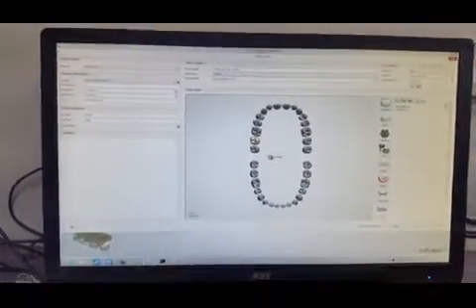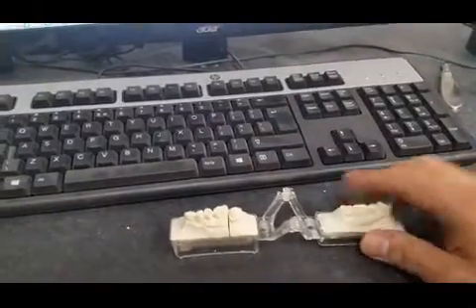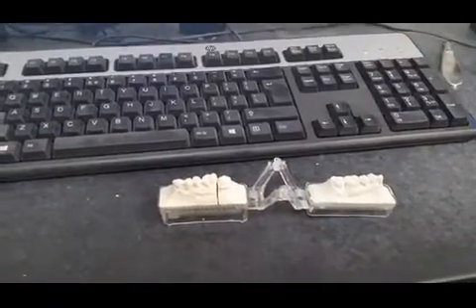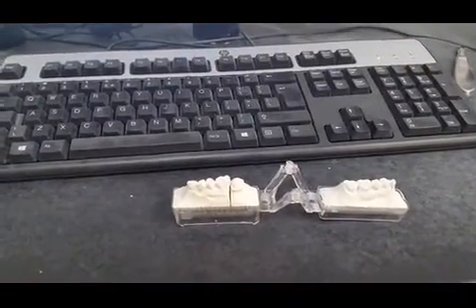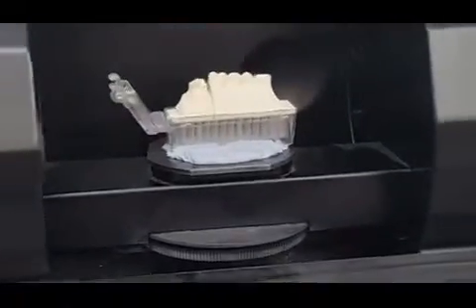And then we're going to go scan. It's going to open a screen. And here's the scanner. And here's the case. And we're going to go ahead and put the prep side first to go ahead and scan that first. Here's the prep side inside the scanner. We'll close the door and it's gonna start scanning.